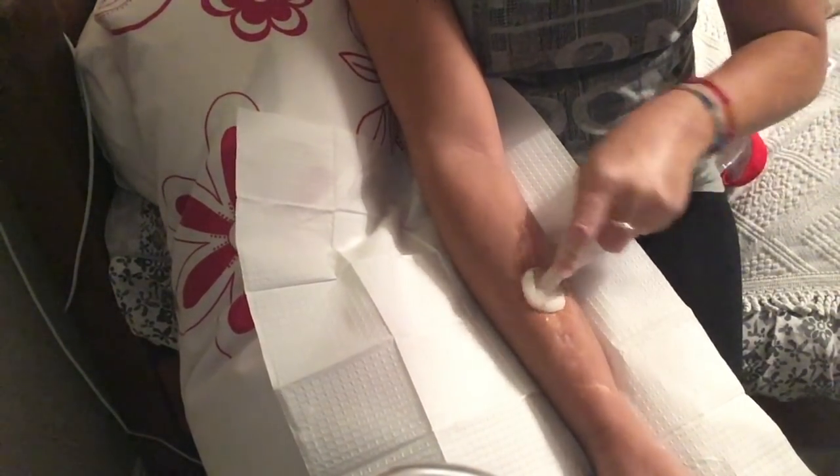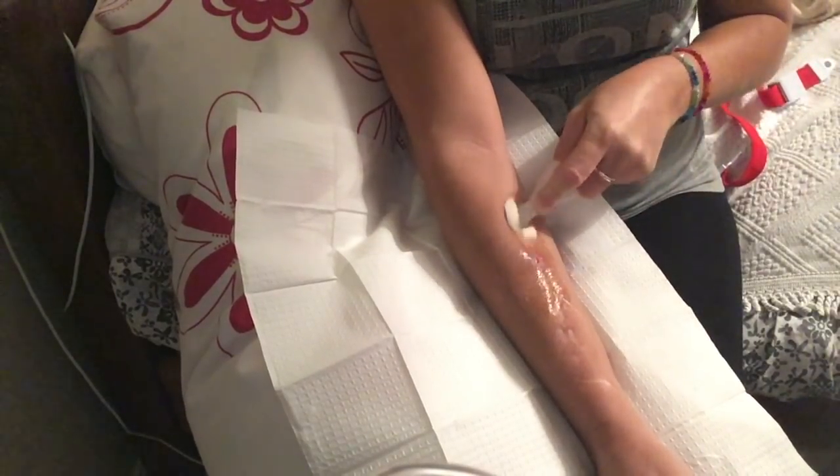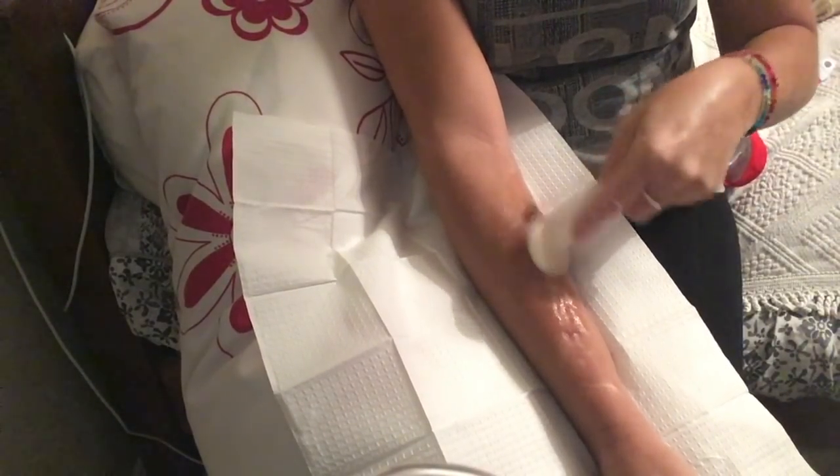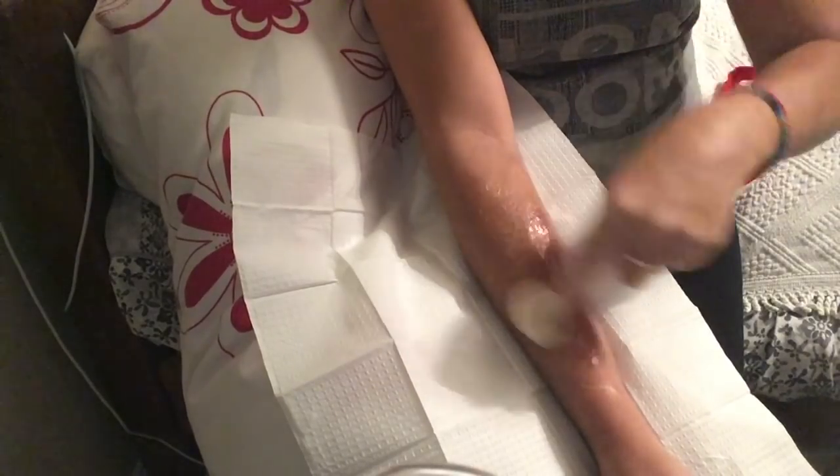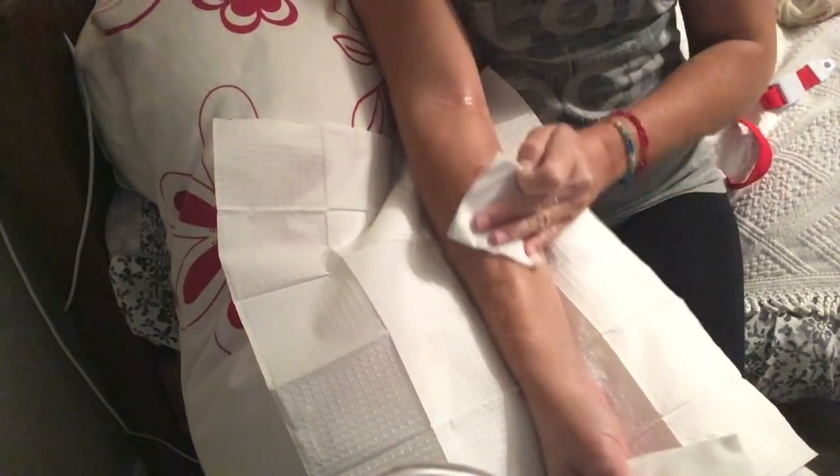I make sure each site is completely soaked in alcohol. I've also washed my arm anyway, so I know it's clean. Then I use some gauze and make sure that it's dry.